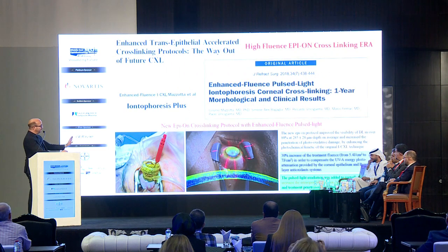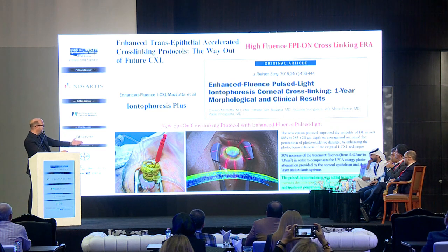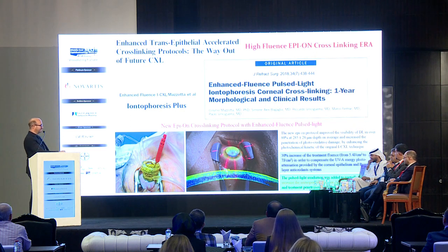I changed the iontophoresis protocol, enhancing the fluence. And you can see there the demarcation line. It was similar to epi-off. And it was enough to improve the fluence from 5.4 to 7 and to include the pulsed light treatment instead of the continuous light.